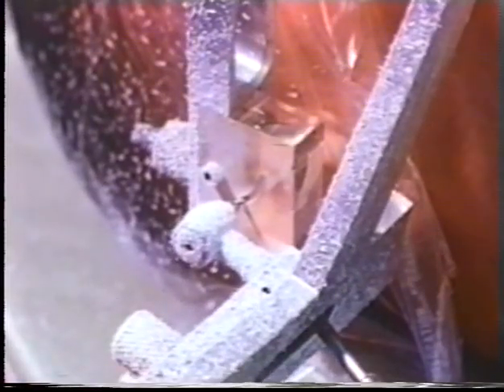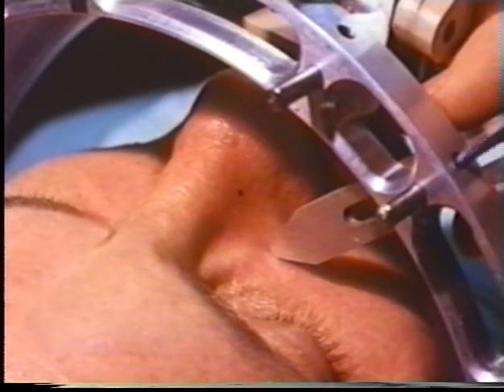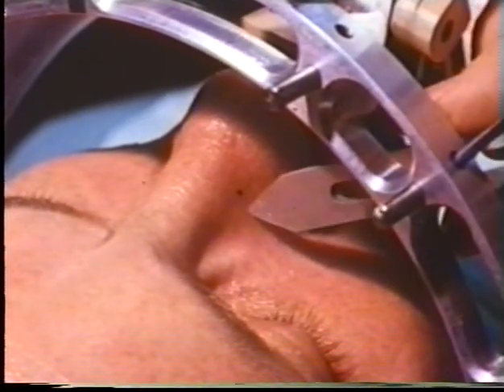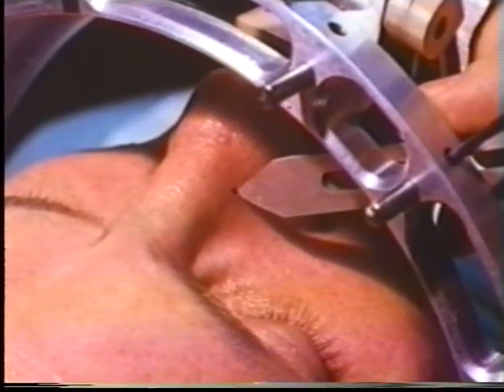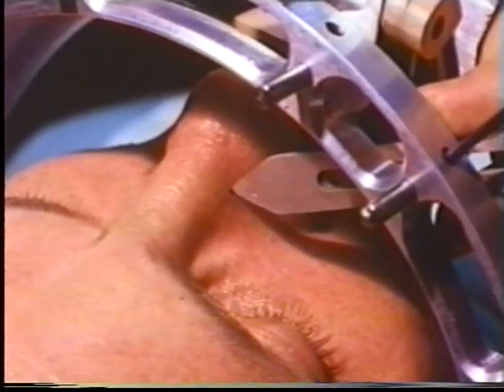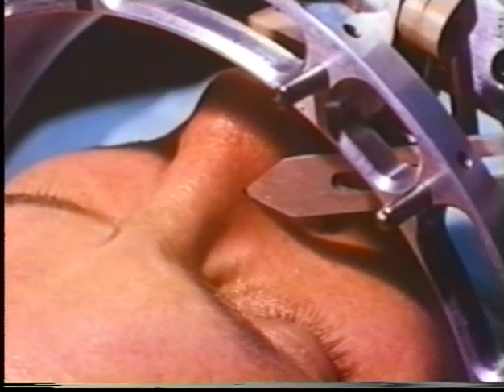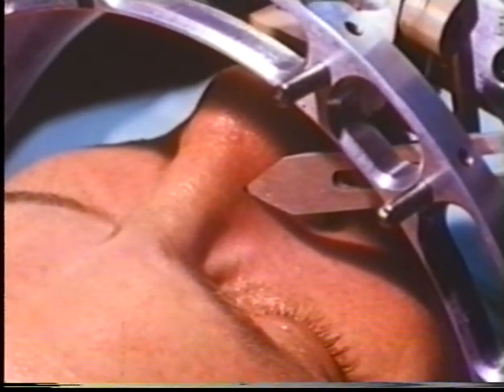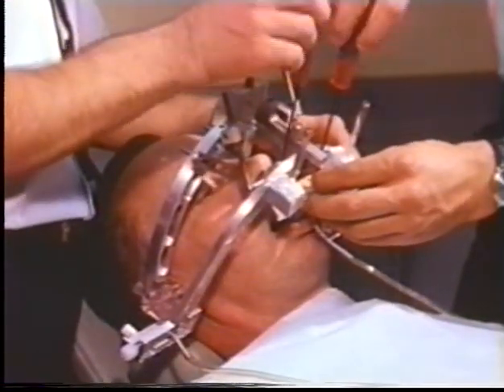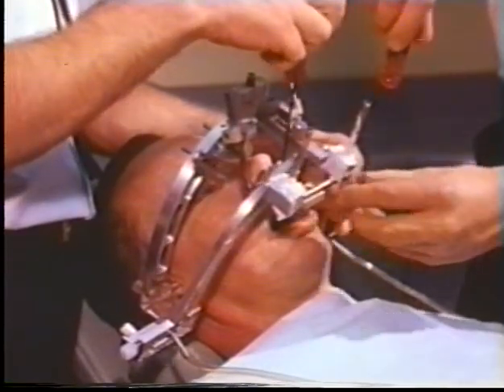The mandible is returned to centric relation with the recording drills inactivated. The anterior reference pointer is adjusted and secured to the orbital spot on the right side of the nose. Note that the orbital spot has been marked temporarily with dark ink for photographic clarity. The recording equipment is removed from the patient by loosening the attachment clamps.